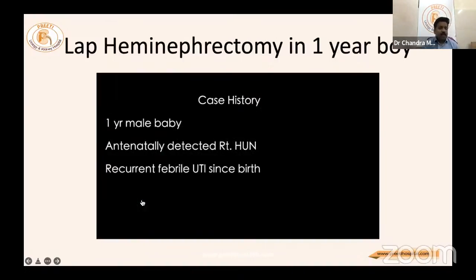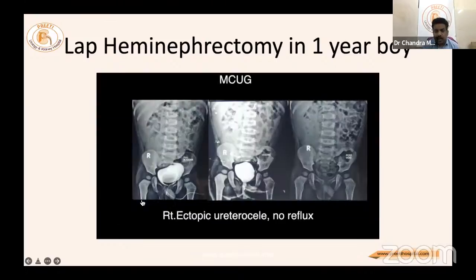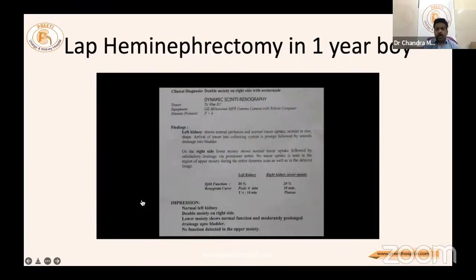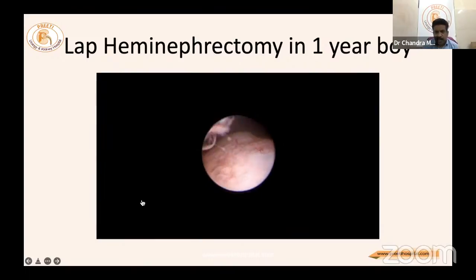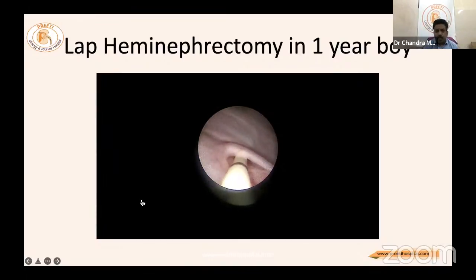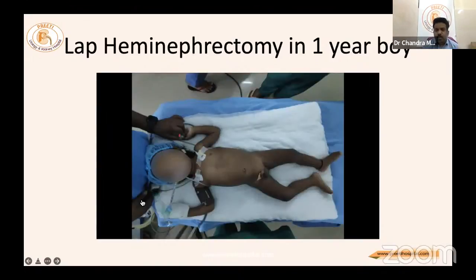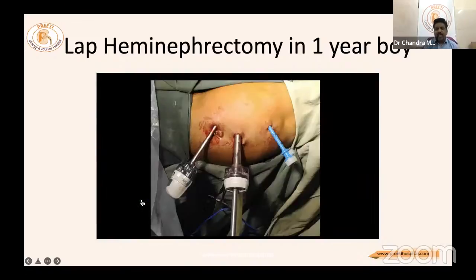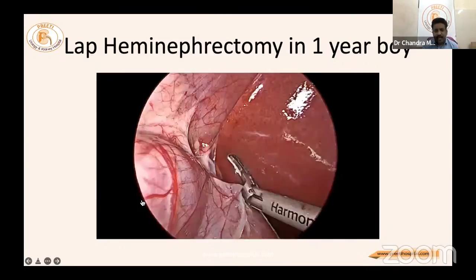Case 2: Laparoscopic hemi nephrectomy in a one-year-old baby with a large dilated upper pole — upper pole obstructed, lower pole refluxing. The right kidney is functioning only 20%. Cystoscopy is mandatory; identification of two ureters is essential. If possible, a ureteric catheter is placed in the normal lower pole ureter. The small baby is positioned as for any laparoscopy, using a 10 mm port only.